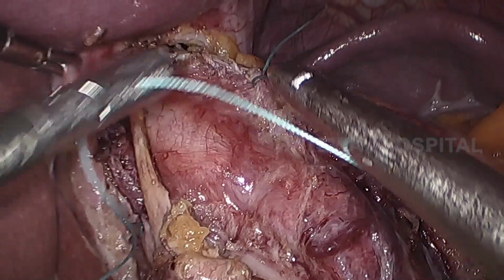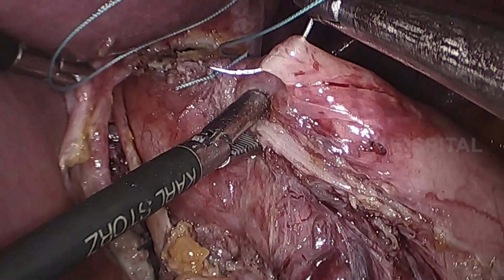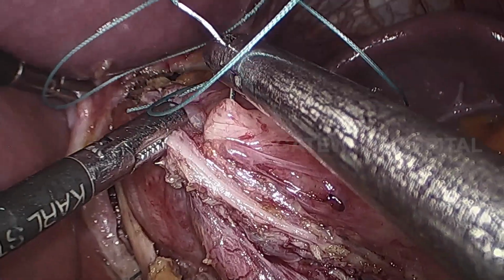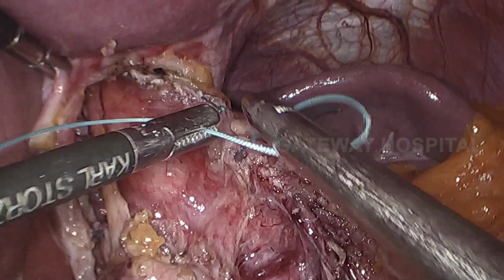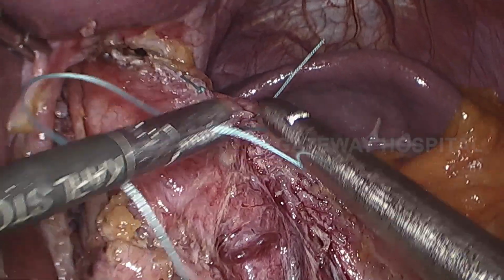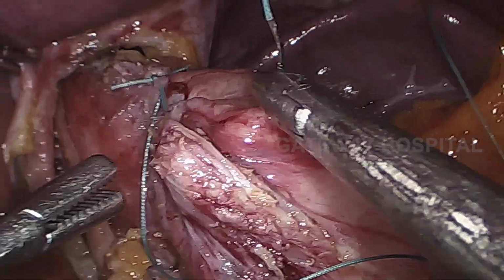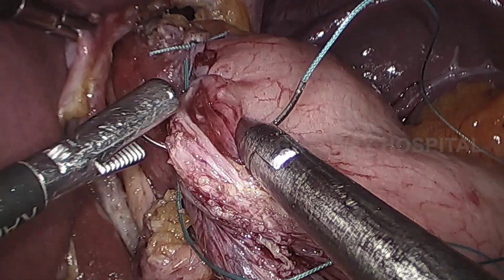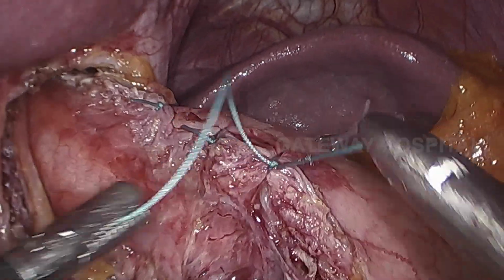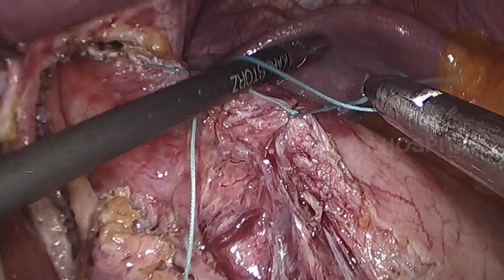Sometimes if you feel after completion of the posterior 270-degree fundoplication that the hiatus is very wide, we can put 1 or 2 stitches to the crura, that is cruroplasty. That also can be done. In this case we actually used 1 stitch to reduce the size of the crural opening, so that the entire wrap will not migrate into the mediastinum.